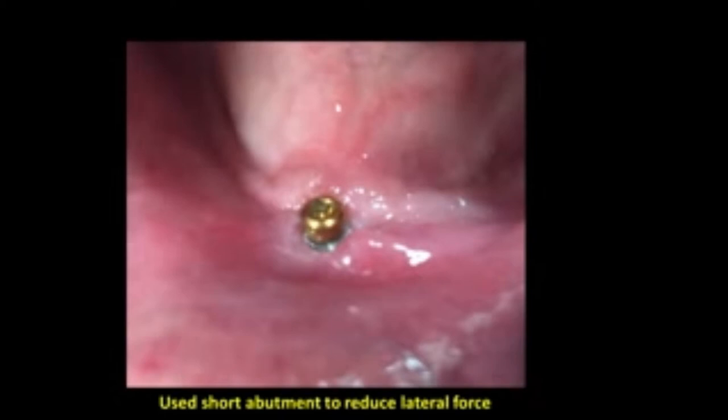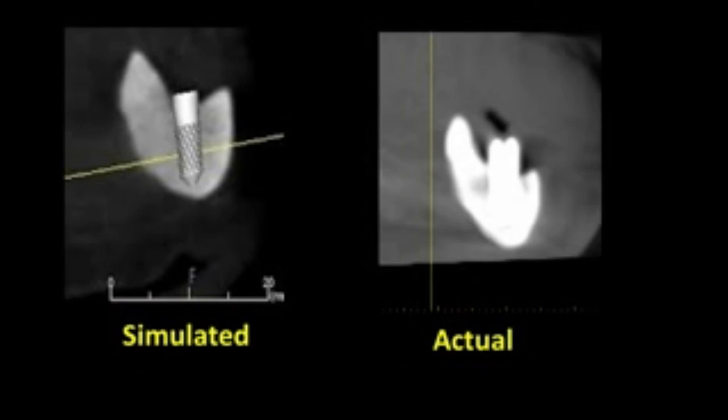Here's the implant in place with a scan. This is a very significant slide — the prosthodontist used a short abutment in an attempt to reduce the lateral stresses on this implant. Specifically, this is the new mucogingival junction. I'm a firm believer that implants have a better prognosis if they're surrounded by keratinized tissue, which this implant does have. Here we see a simulated scan, an actual scan, again simulated, and again actual.